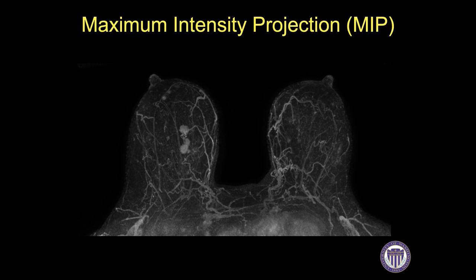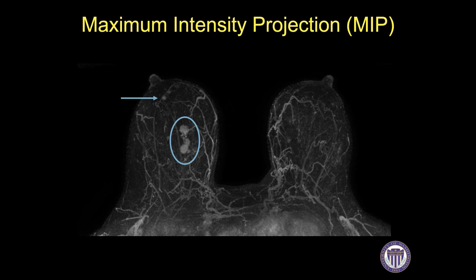Maximum intensity projection images help us better understand the relationship of multiple lesions. In this case, we see multiple masses in the central breast representing the patient's known breast cancer, but there is also a small mass in the anterior breast that was subsequently biopsied and shown to be another area of invasive cancer. Our surgeons find MIP images particularly helpful for understanding the orientation and relationships of multiple lesions within the breast.